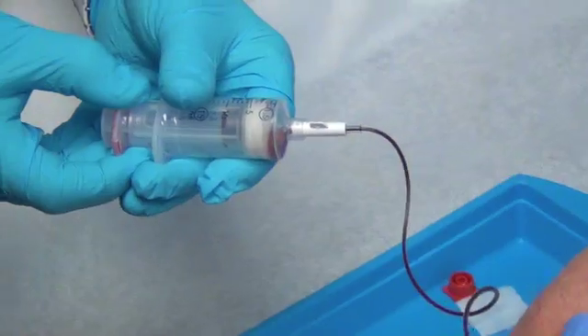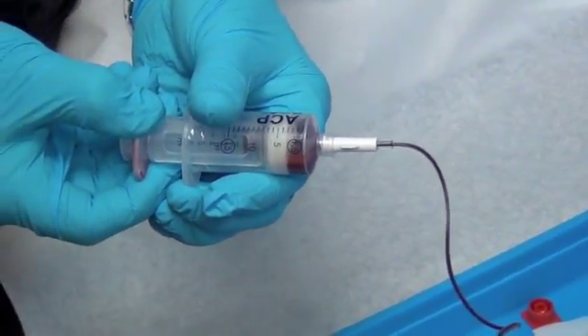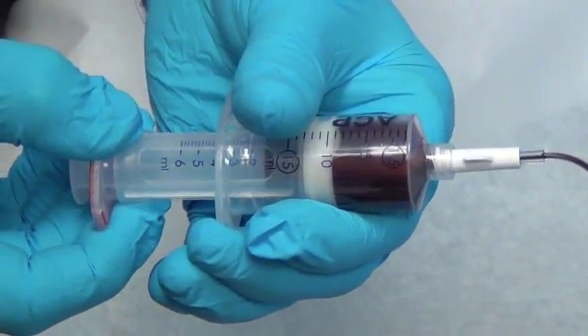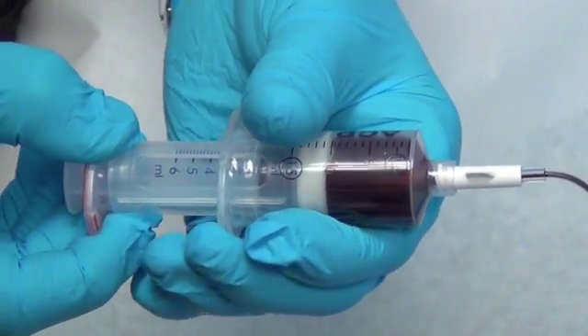Then we're going to draw the blood from the right arm. This is a proprietary double barrel syringe and what we're doing is we're drawing about 10 to 15 cc's of the patient's blood.